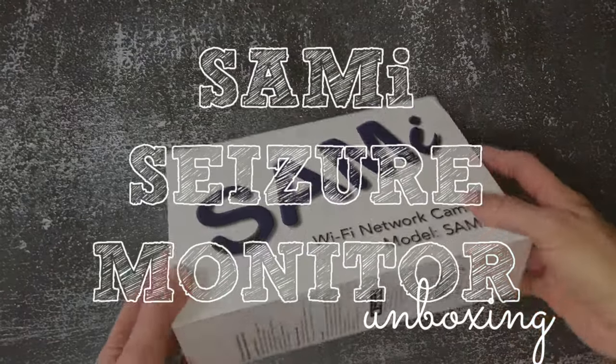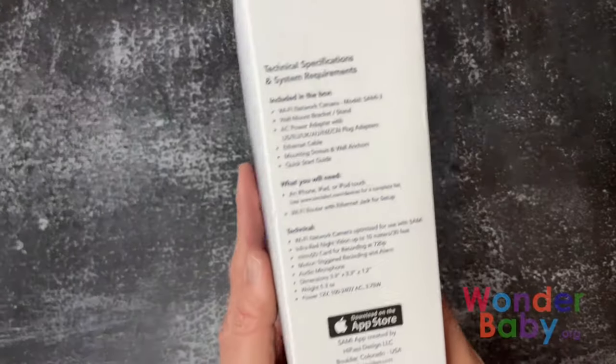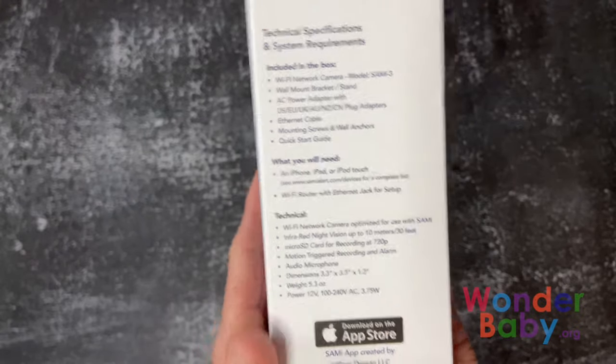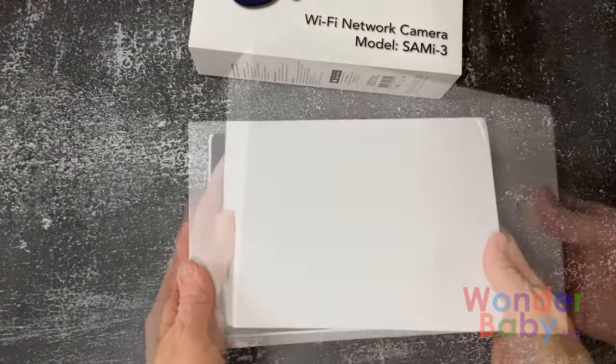This is the SAMI seizure monitor. It has the system requirements on the side of the box. Essentially you're going to need a Wi-Fi router and an Apple device so that you can run the SAMI app on your phone or tablet.